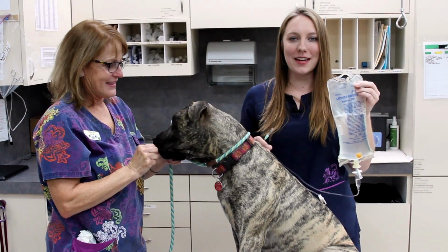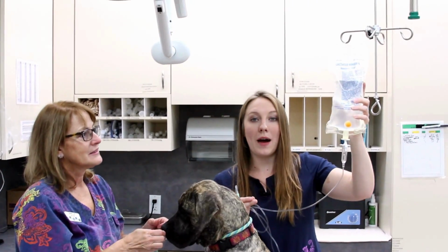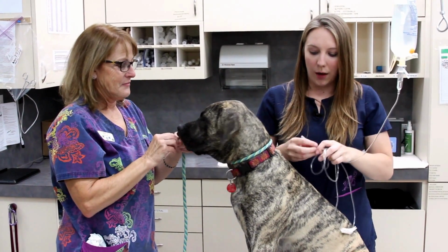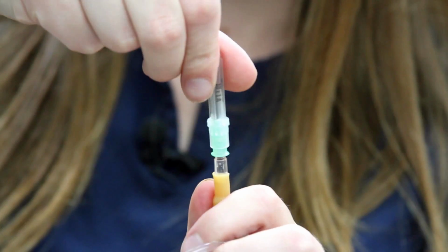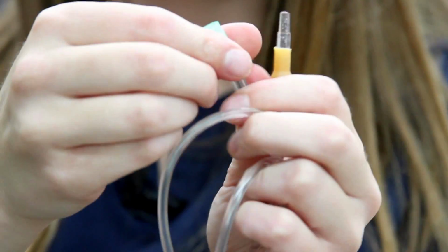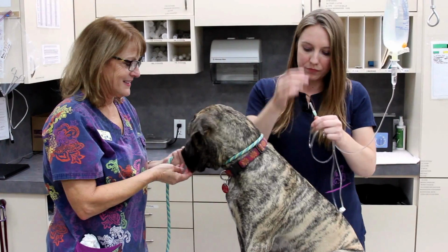Alright, so when you guys are ready to give the fluids, hang the fluids on a hook at home or somewhere up higher where it's going to help gravity release the fluids down. Then all you're going to do is replace the needle on there with the new needle, so you're going to twist to get that needle off. We are then going to take our new needle and take off the plastic piece on the bottom and then put a new needle on.